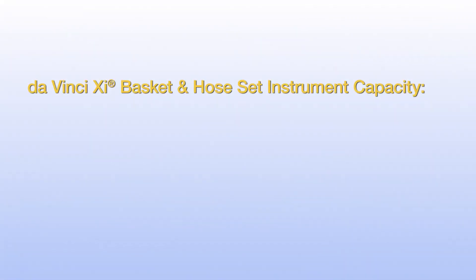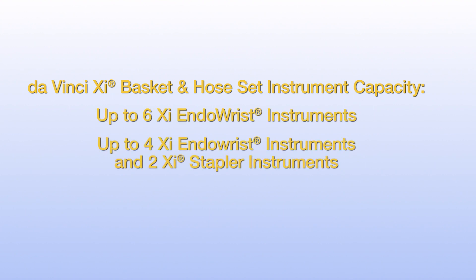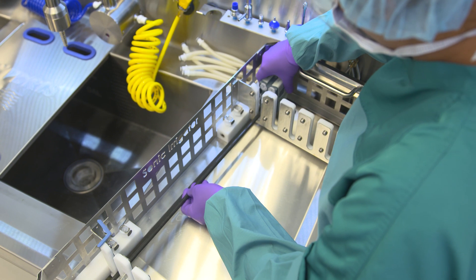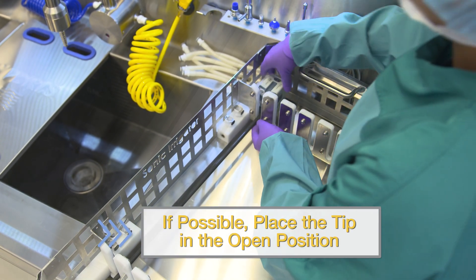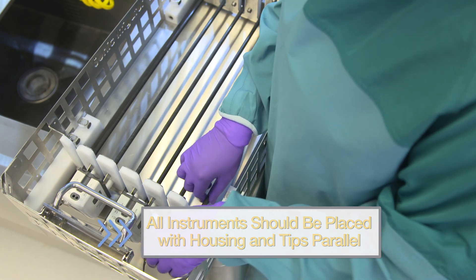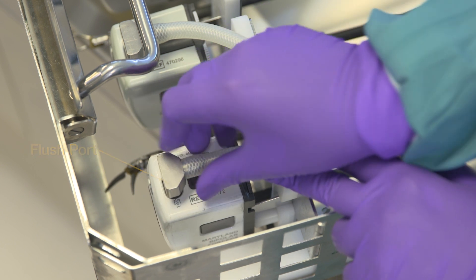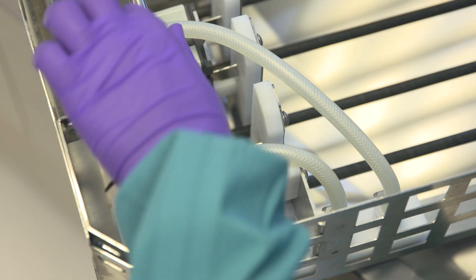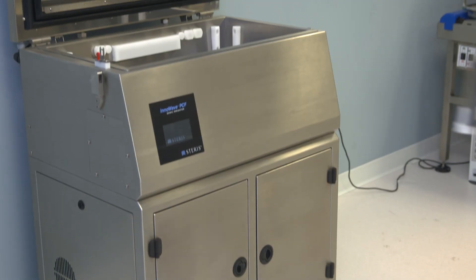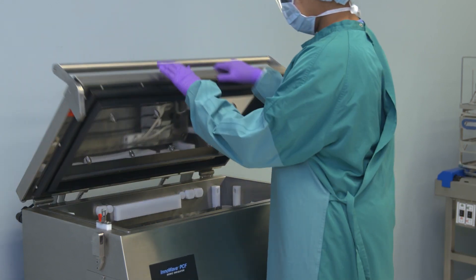The DaVinci XI basket and hose set holds up to 6 SI endo wrist instruments, or 4 SI endo wrist instruments and 2 SI stapler instruments. To begin loading, place the instrument on the supporting frame and, if possible, place the tip in the open position. All instruments should be placed with the housing and tip completely parallel. Connect the hose to the basket manifold until you hear a click, then connect the hose with metal tips to the flush port located on the mechanism housing of the instruments. Once the basket is properly loaded, gently place it inside the tank, aligning it with the guide rails, and secure into place.